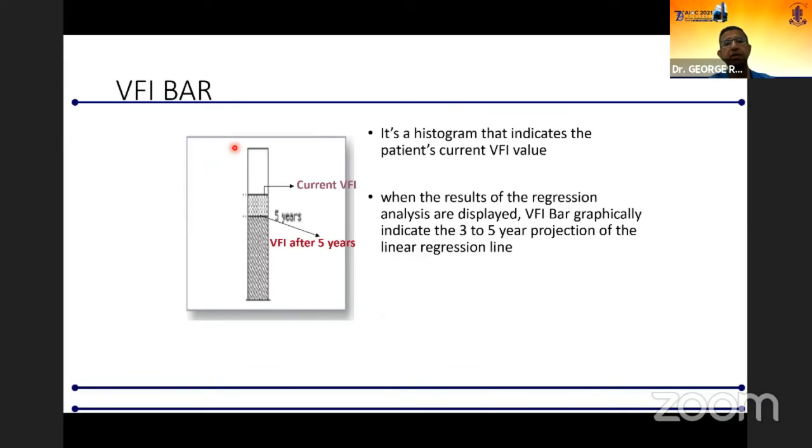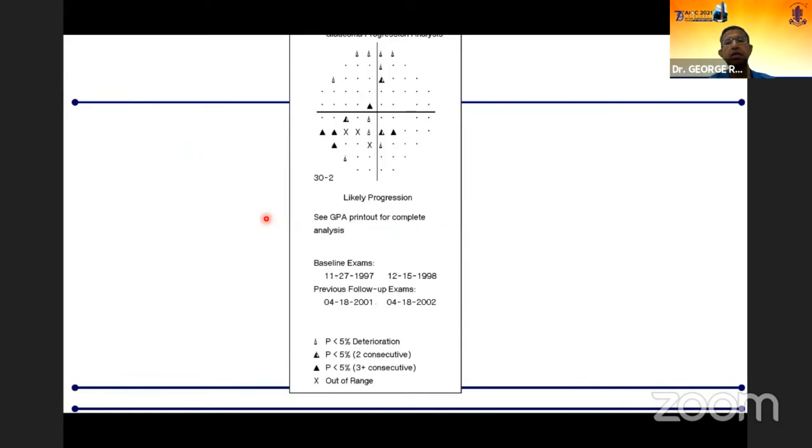You need at least five exams over a three-year period to accurately predict this. It also gives you the VFI bar where it tells you that if this patient continues to progress at this rate, this is where his visual field index is going to be after five years. In addition, on the event analysis, each of these points is classified with an open triangle, a half black triangle, or a completely black triangle, depending on whether that point has deteriorated one visit, two consecutive visits, or three consecutive visits.